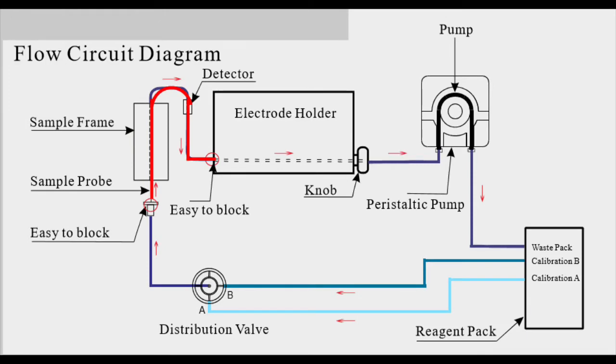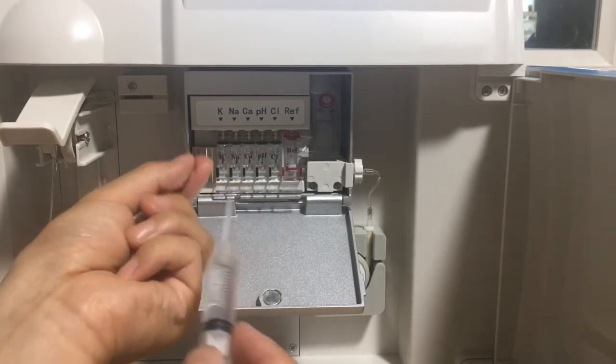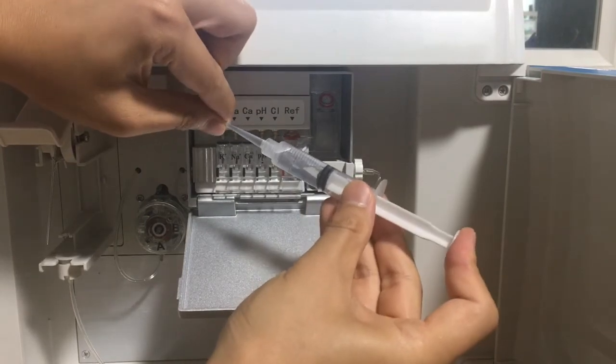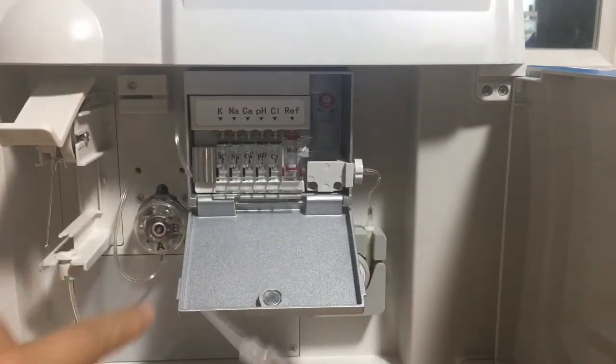Next, we check the part marked in red. We use a small cup to collect water from the probe. We inject water from here, and we can see the water coming out from the probe, which means this part is okay.